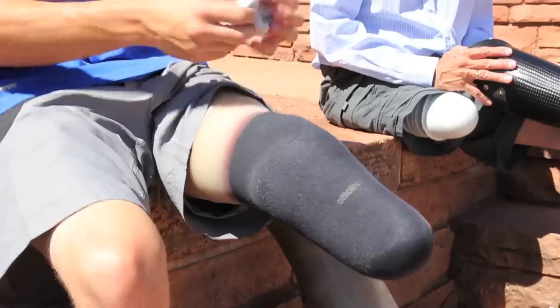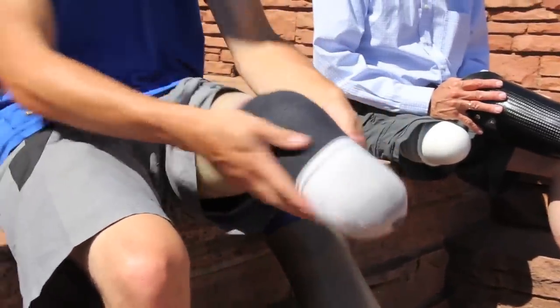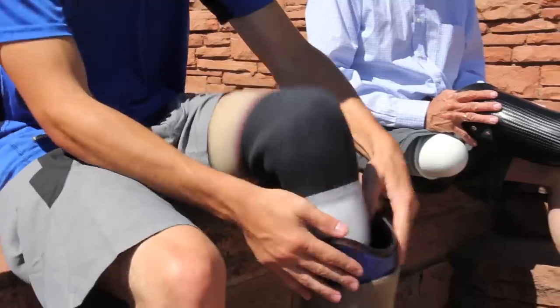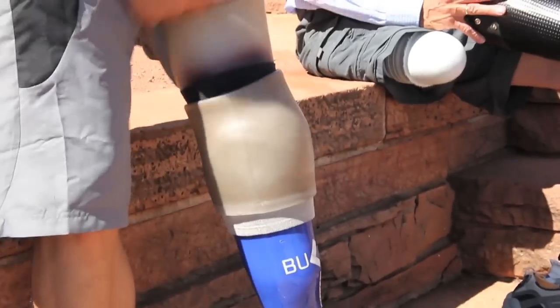As the residual limb matures, it will begin to change in size and shape. To maintain an appropriate fit of the prosthesis, different thicknesses of socks are added to compensate for any loss or gain that has occurred both throughout the day and over the months and years after the initial fitting of the socket.